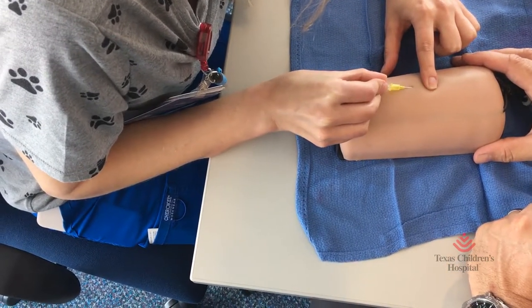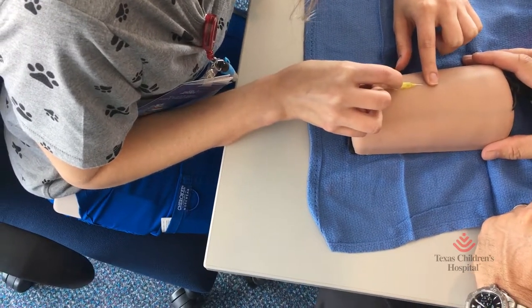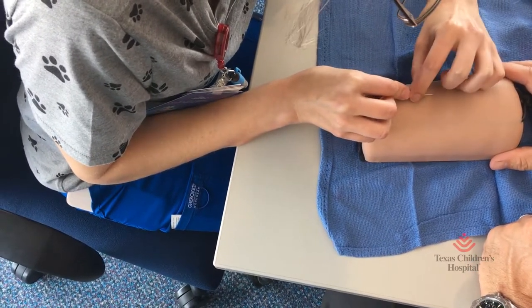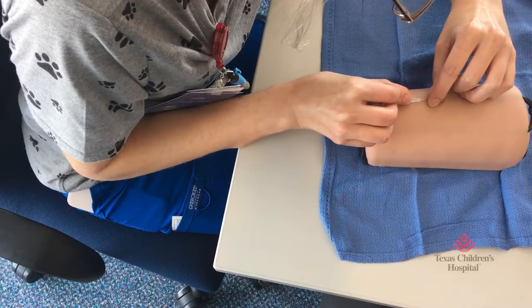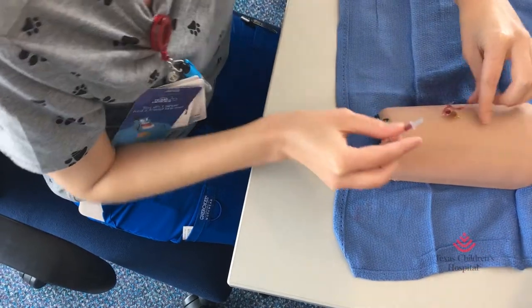Confident. Forward portion — this is when you still don't want it in the patient. Drop it. And then usually you can — there you go. Perfect. And then you withdraw your needle and then you're good.